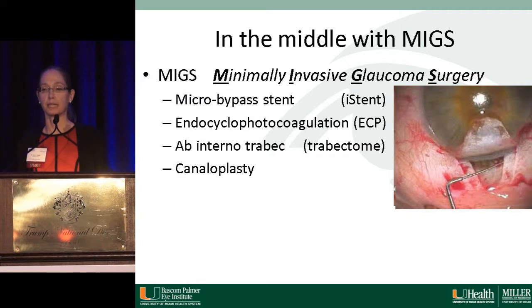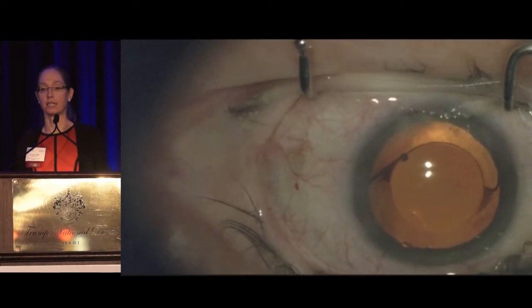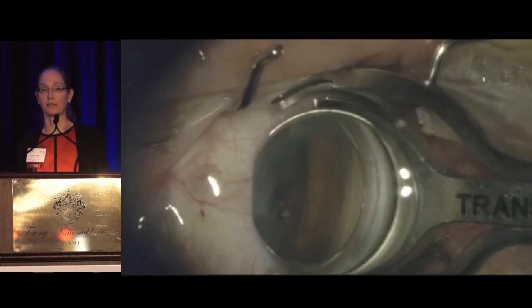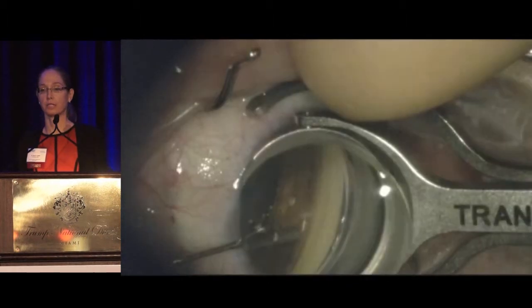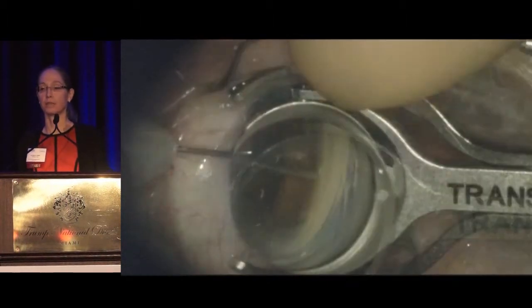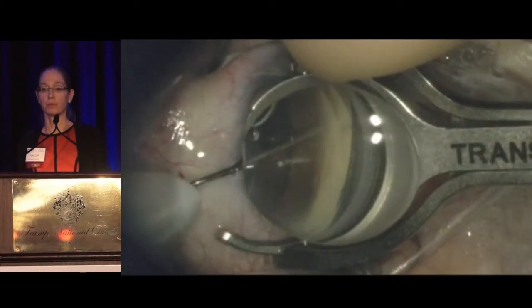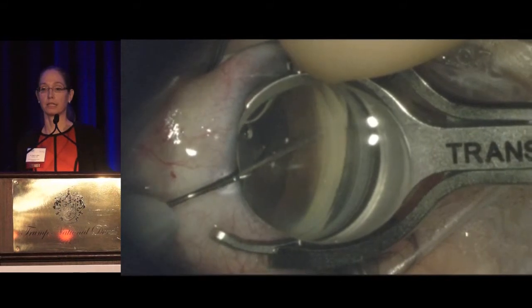That's the trabectome, that's canaloplasty. I'm going to spend my last 20 seconds showing this video, if it will start, of an eye stent procedure, which is something that can be done after a standard phacoemulsification procedure. You just place a gonio prism. You have to have a good view of the anterior chamber angle. And you can use this inserter to place this very small stent.